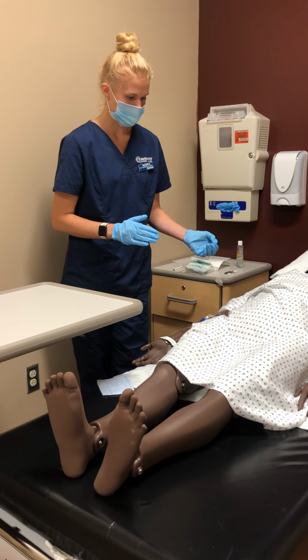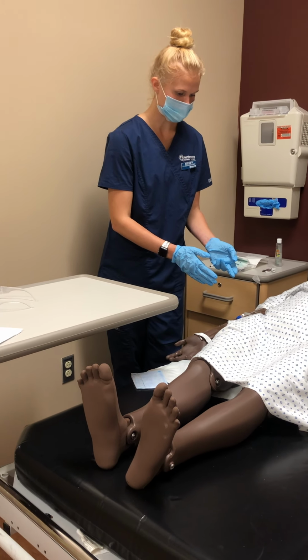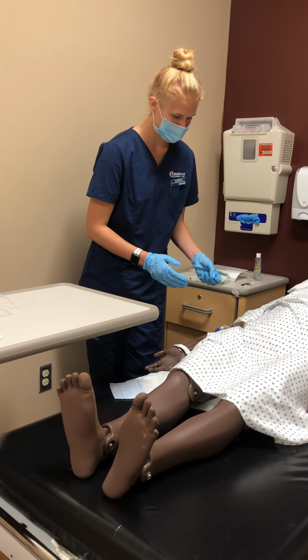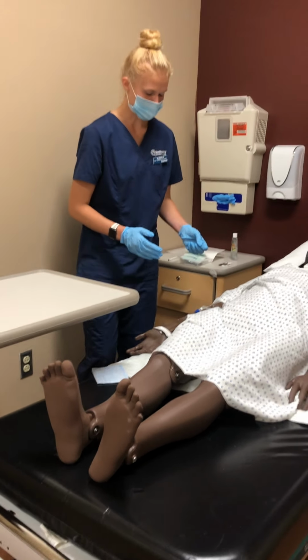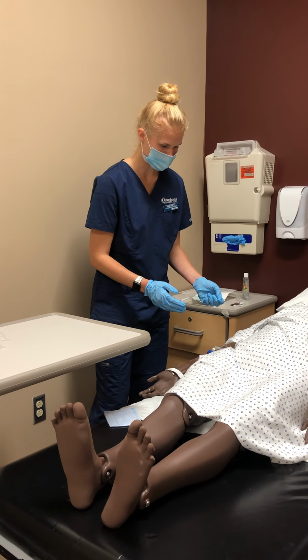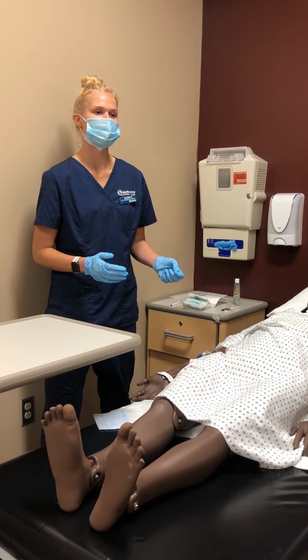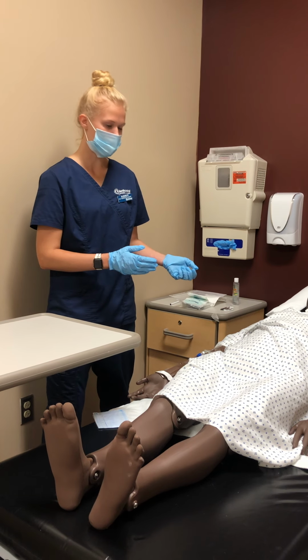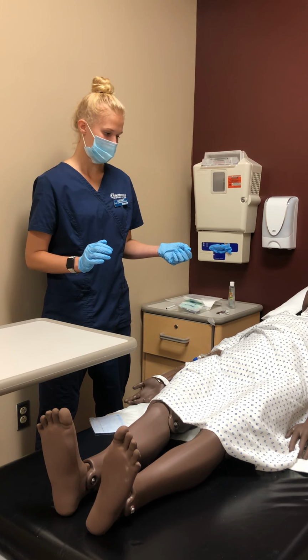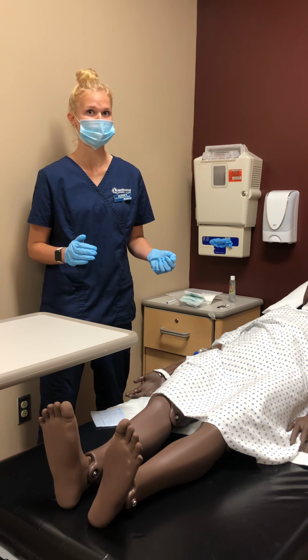Then I would also label the external length of the catheter, inspect the catheter from the hub to the site, and document those findings. I would always compare all my results to the last results, and if there was a half inch deviation, that would be a concern.